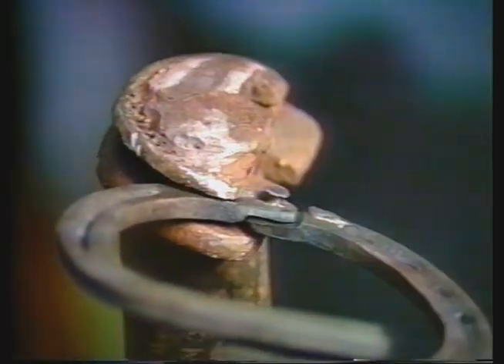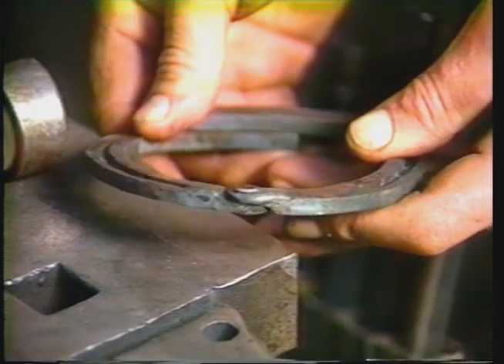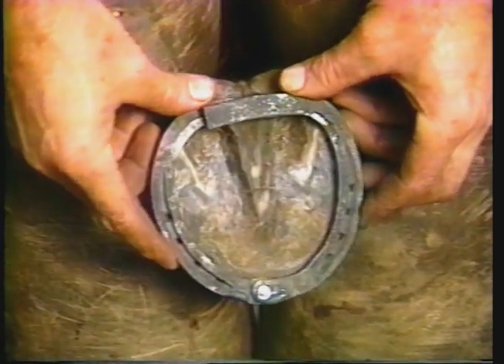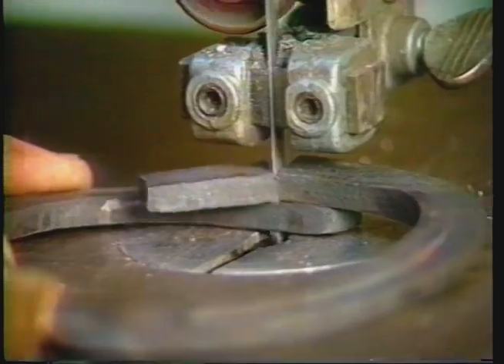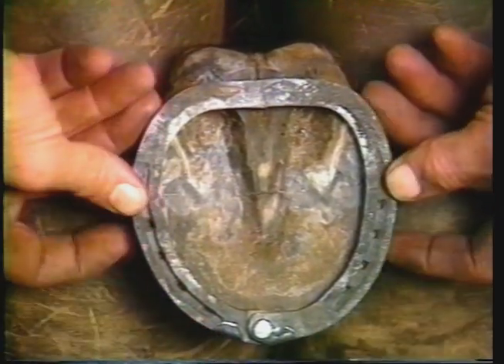Once the borium is on, if you spill over into your hole just open it up again using a 3/16 bit. Put your rivet in, grind the rivet down, and while the rivet is still hot from the grinder, gently brad it down. Do not brad it down overly tight because you'll be doing this off and on several times through the procedure. Then go back to the foot and make your final fit. It's a little difficult to fit perfectly because the heels will be lapped over. After a while you become accustomed to fitting it up very nicely. Once you have the perfect fit, go to your bandsaw and cut through the heels, then level the shoe and go back to the foot for a final adjustment. Remember, do not abuse the shoe because the hinge will take all the action off that hammer.